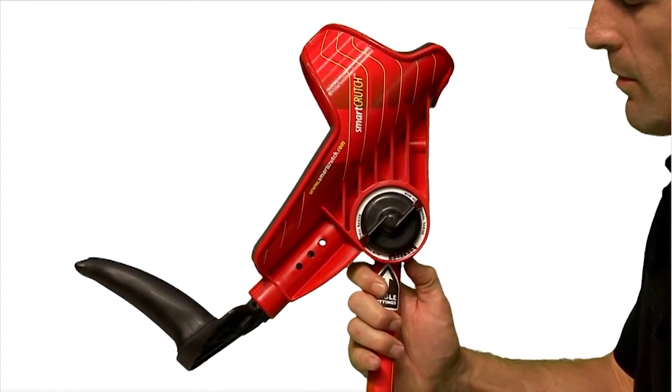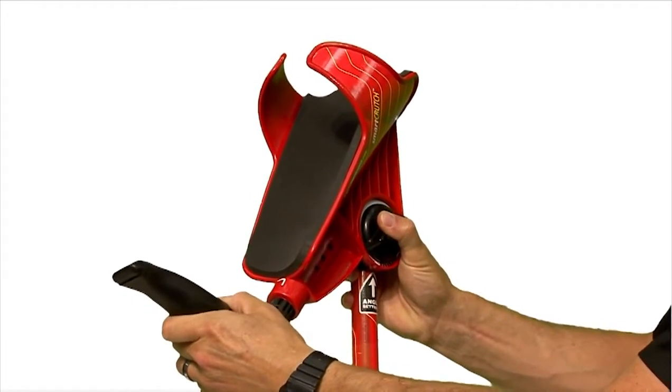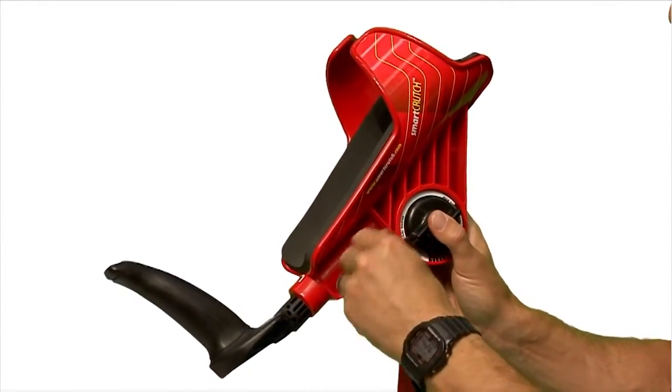Align the grip shaft hole with the second position setting and reinstall the bolt and wing nut, tightening the wing nut adequately to ensure the grip is securely in place. Recheck the length and adjust again to the next position if required.